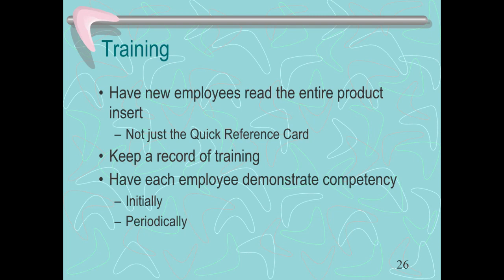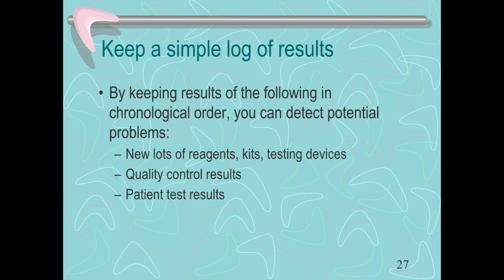And if you don't know how to do something, ask. Don't just assume you can do it by reading the directions. If it's still confusing, ask how to do it. Find someone to show you. Once again, keep those logs.